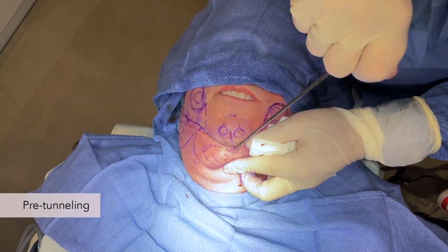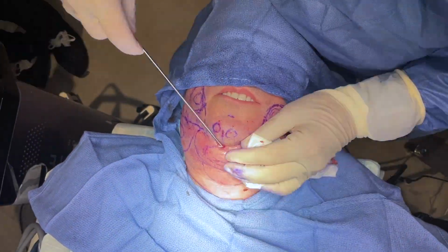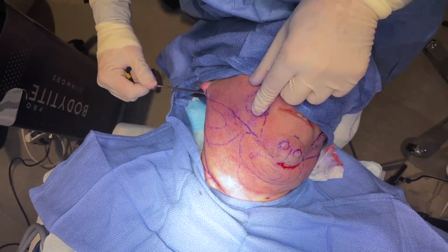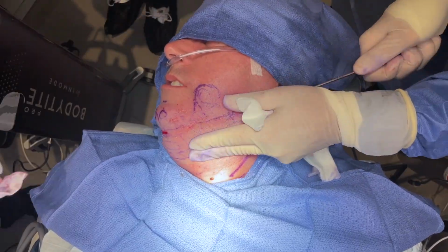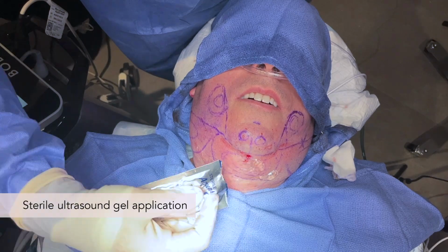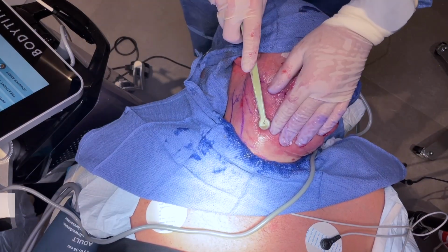Next is a pre-tunneling that I'm doing here for FaceTite. It's important that the skin is nicely released. And note that there is no suction at this step of the process. We're just doing some pre-tunneling so that when we insert our probe, it's going to go in and out really nicely. Next is our sterile ultrasound gel here. This helps us with coupling.